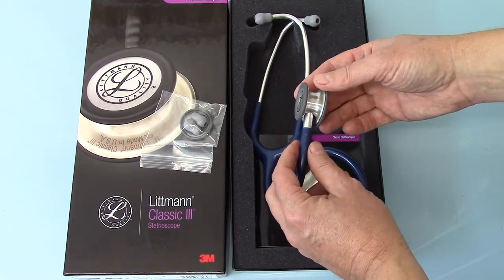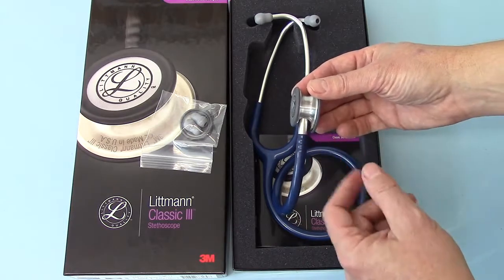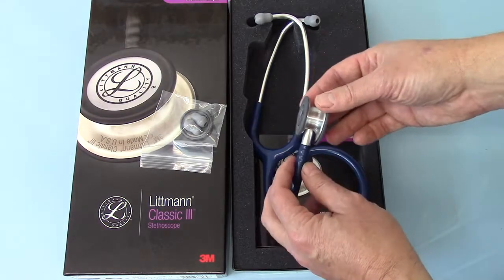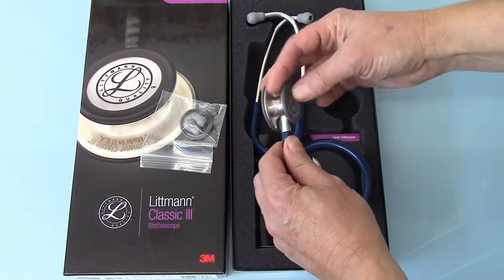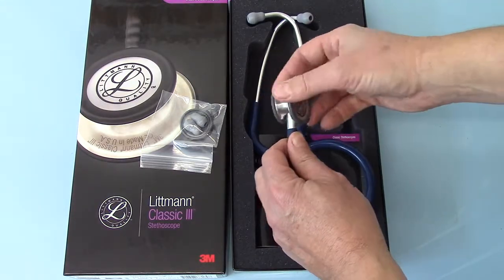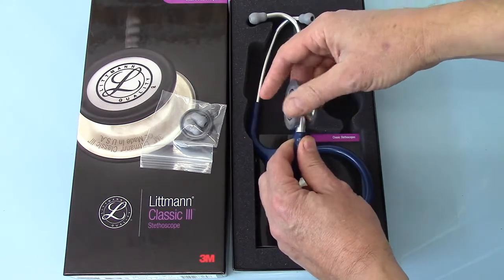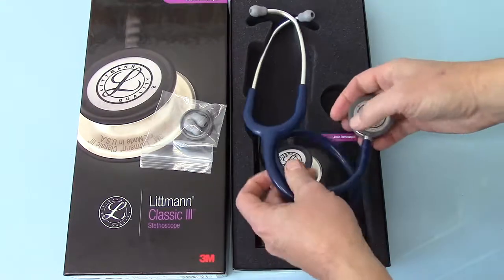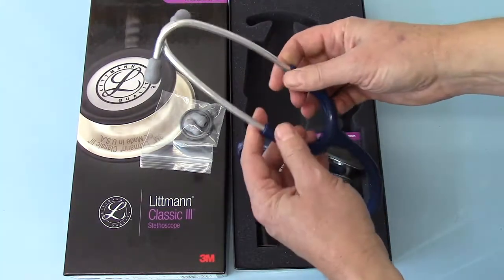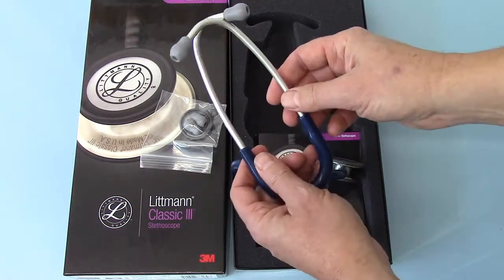It's supposed to be more robust and easier to clean. If you compare this to the fittings on the Classic 2SE — the older model — you'll see that it is more robust. It's a standard rotating with ball locking configuration on the chest piece. The mount is very strong and very robust.